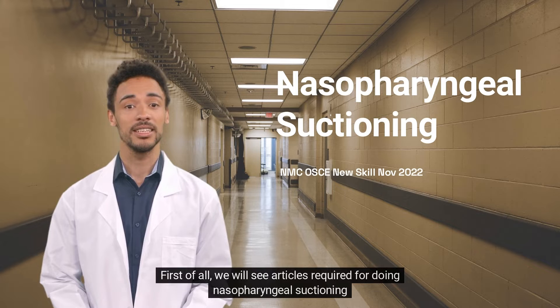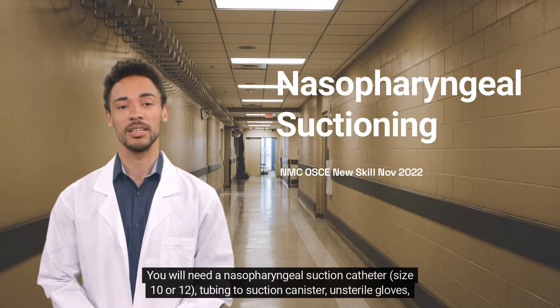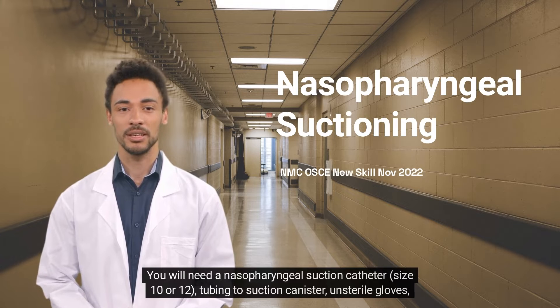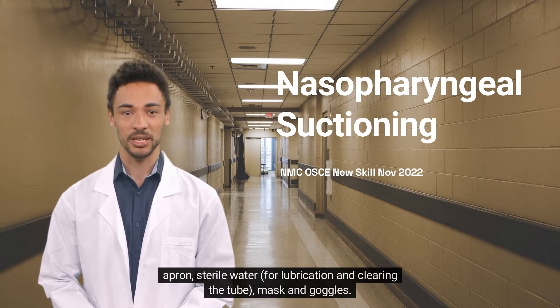First of all, we will see the articles required for doing nasopharyngeal suctioning. You will need a nasopharyngeal suction catheter, size 10 or 12, tubing to suction canister, unsterile gloves, apron, sterile water for lubrication and clearing the tube, mask, and goggles.